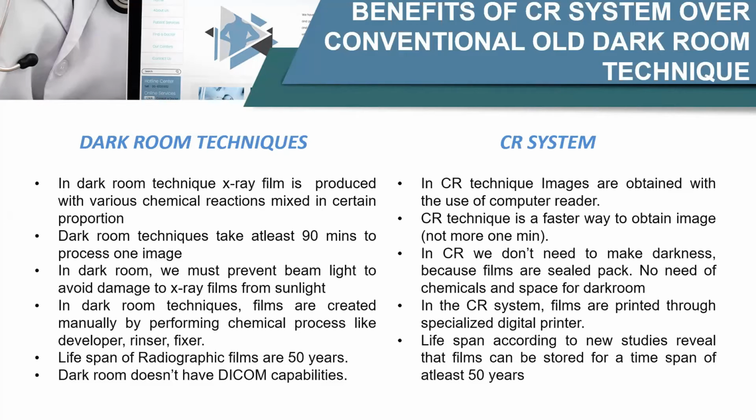In CR system, we need a very small space where we can keep our reader, our computer and a UPS. That's a very small usage, I mean space usage. So next point is in the darkroom technique, we have to go through certain procedures like developing, rinsing, fixing.